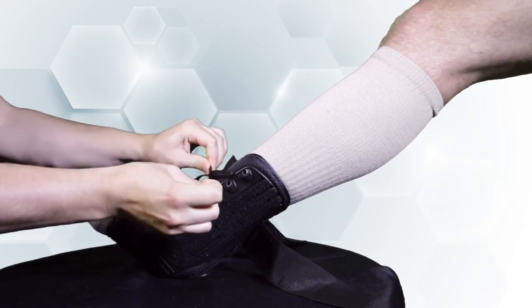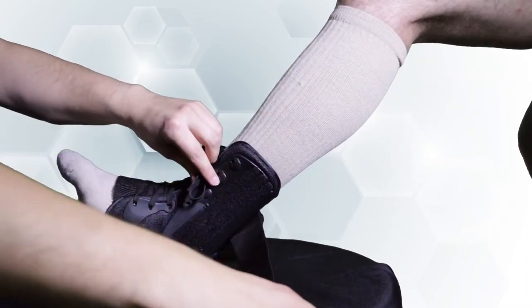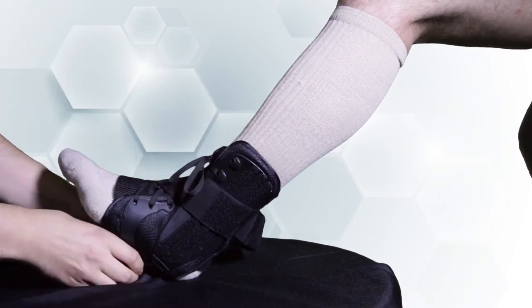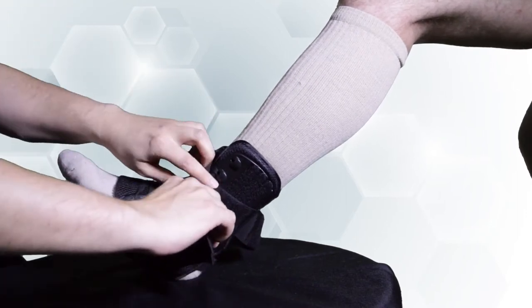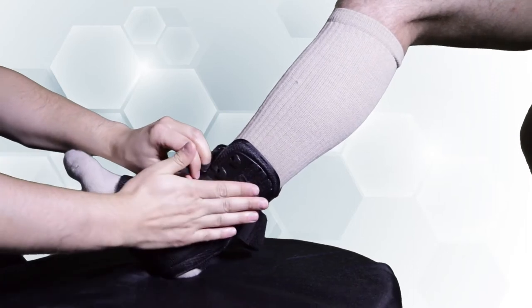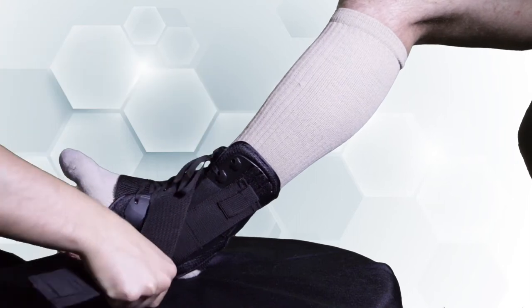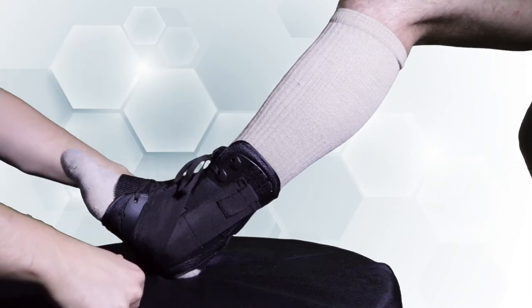After the support has been laced up and tied, take one of the crisscrossing straps and pass it over the instep and then underneath the arch of the foot and fasten it on the other side. Repeat the process with the other strap. This creates a crisscross or figure eight system that provides support and stability by limiting joint movement.